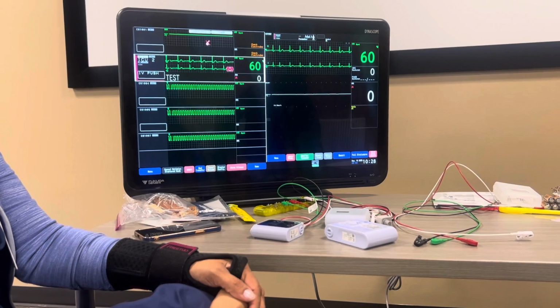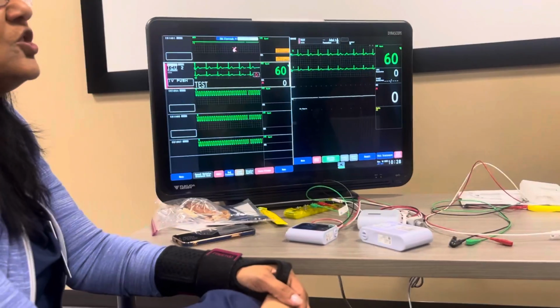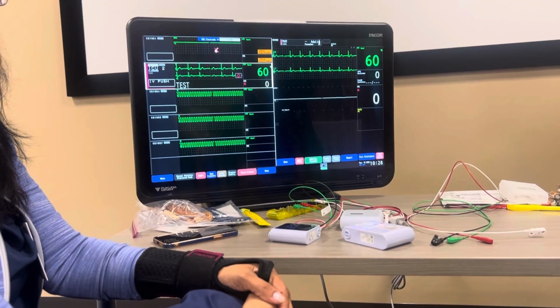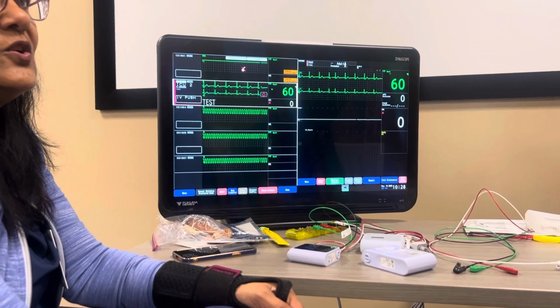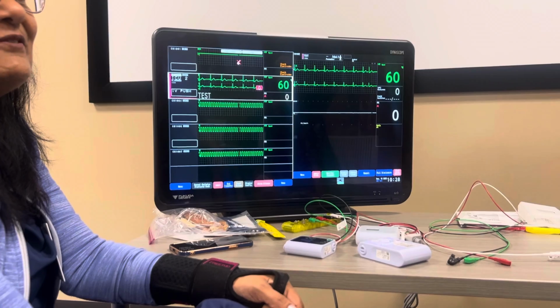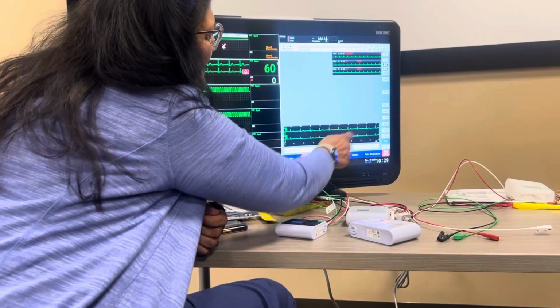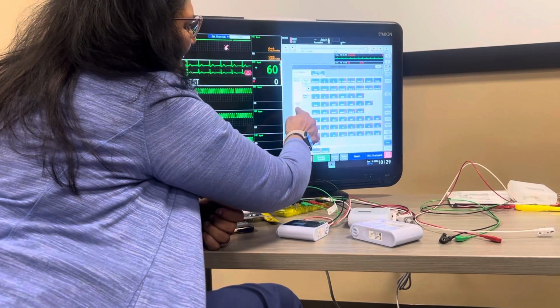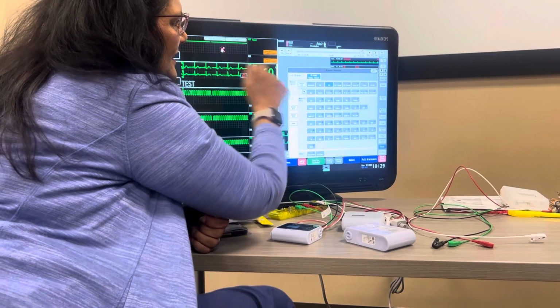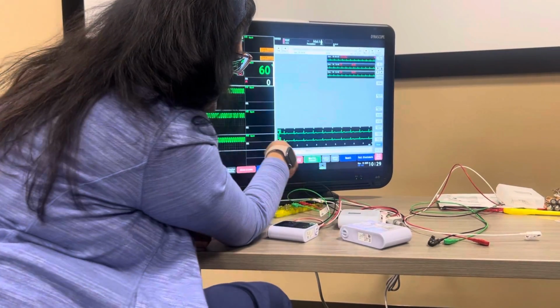Oh, just to see this full screen? Not the full disclosure, recall, but anytime he's had VTAC? Yes. Would you go to full disclosure and choose it in there? You would go to the selections, unselect all, and select VTAC? Yes, but it's not in full disclosure. It's in recall? Yes. Okay. So recall, display selection, and you would cancel all and just hit VTAC. Okay.